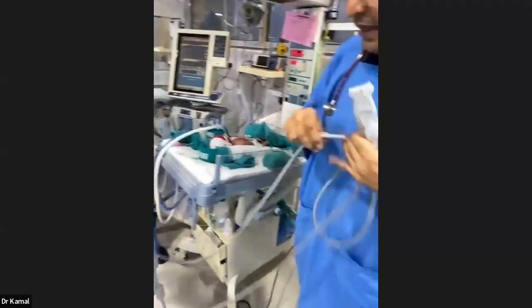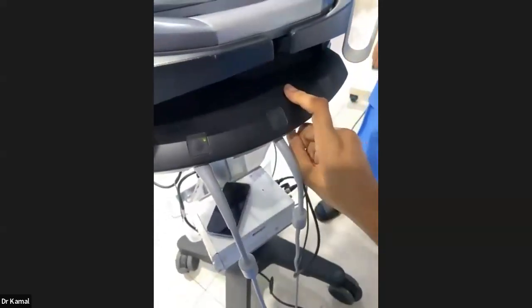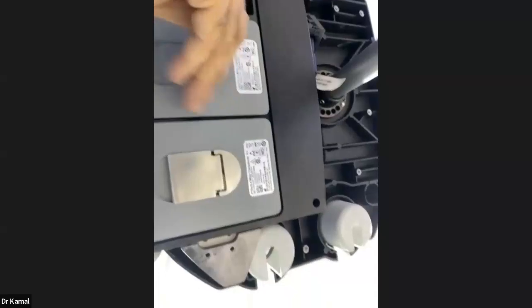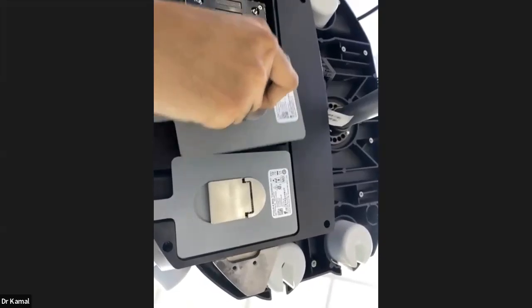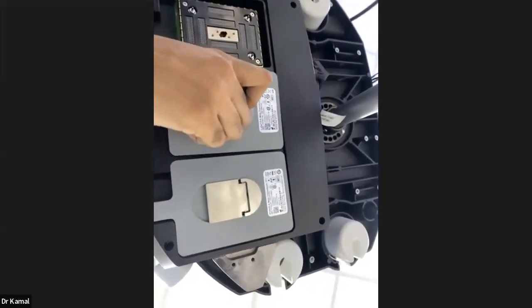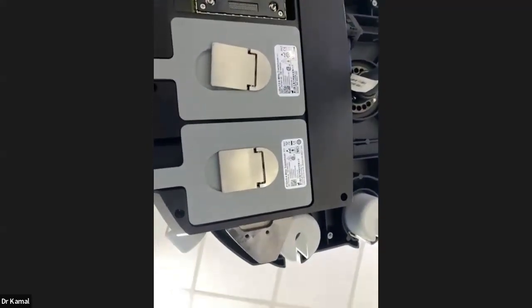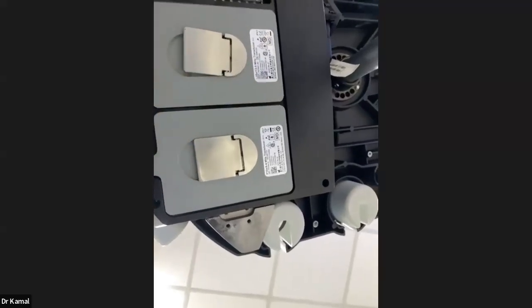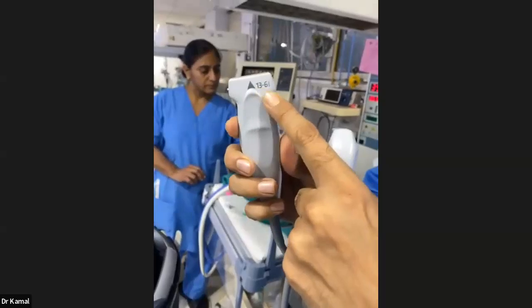Okay. So in the end, coming over here. So again, there is a strain relief over here, and this is connected to the transducer buttons. So if I open it, I can open it and put it on this side. If you want to change, you can again do this, but it has to be done very carefully. Otherwise, what will happen is this will tear off. One button of this breaks off from it. And the similar thing happens here. Clear?